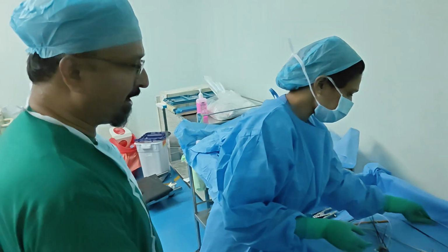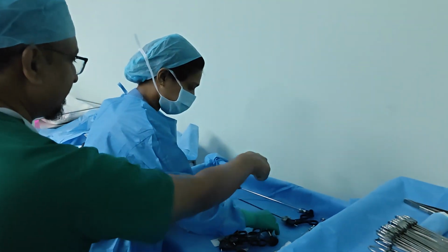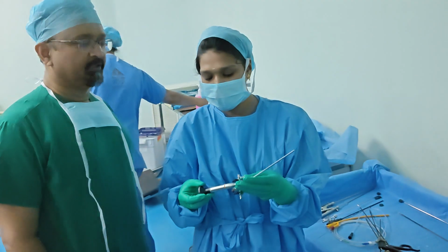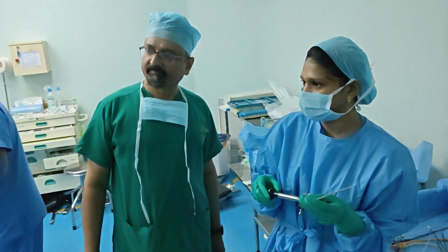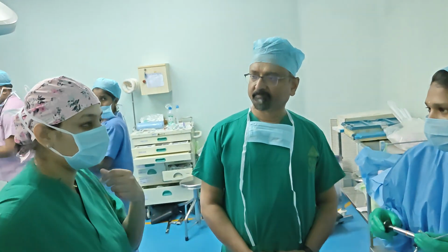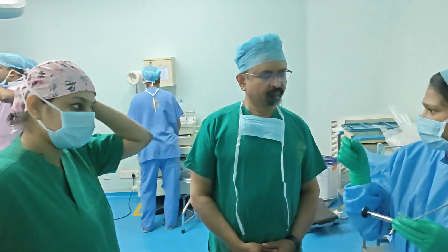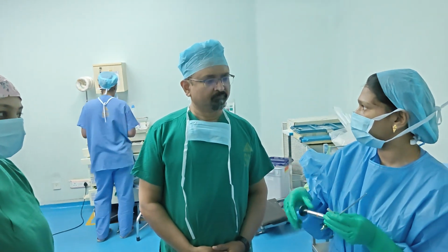Okay. Now you have some other instrument there. Can you show me what is this? This one. Yeah, that one. So what is this? Why do you have it? Compact cystoscope. Why do you need it? So basically, our policy is to check the stent position after we insert the stent, over the lab.